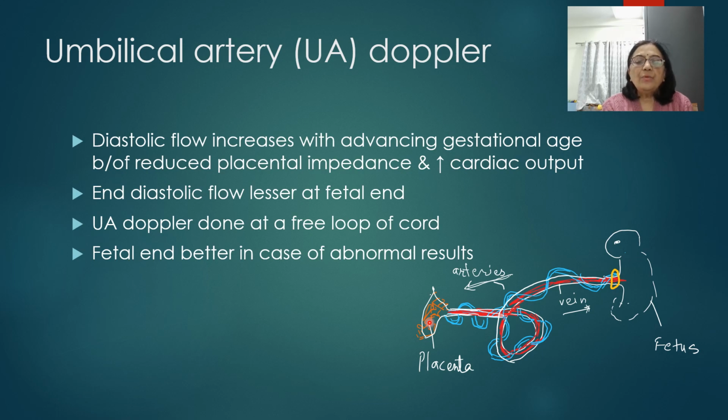Normally what we expect is a good circulation even during systole, but during diastole also we expect an increasing diastolic flow as the gestational age increases.